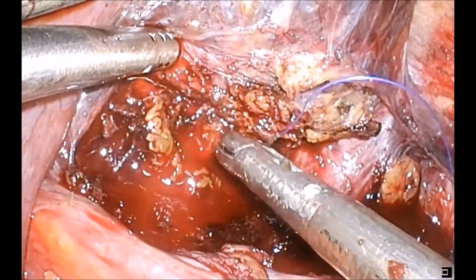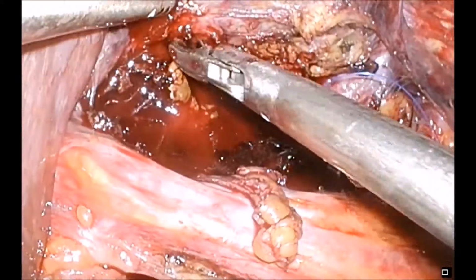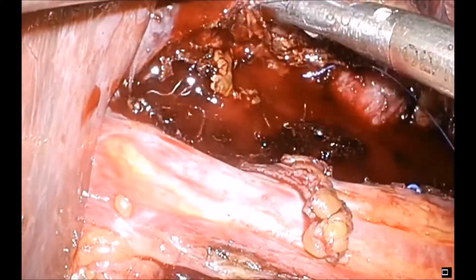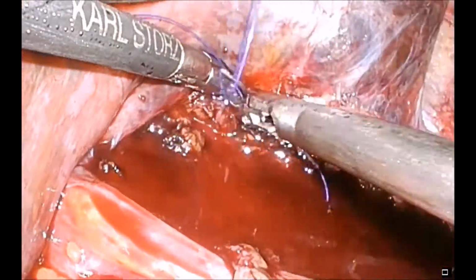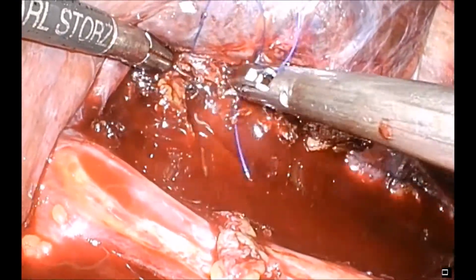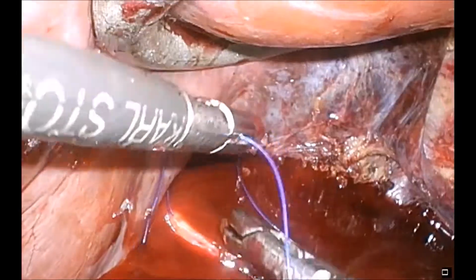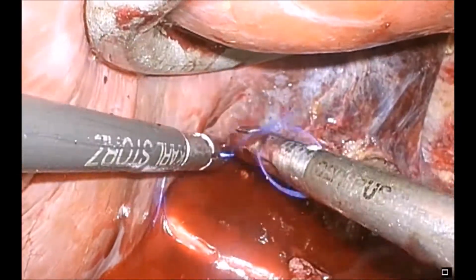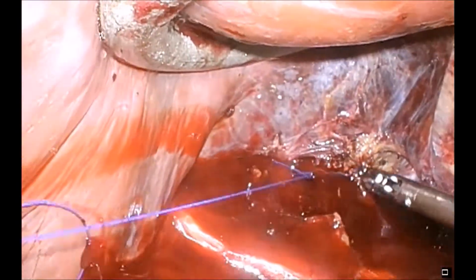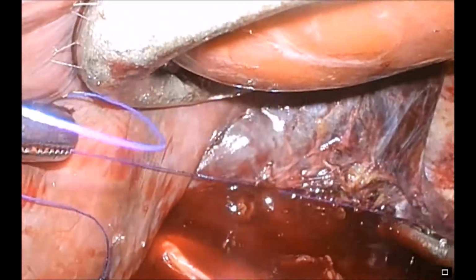Suturing is difficult down this deep hole. Eventually, a couple of throws of the needle allow for the suture to be cinched down around the bleeding point.